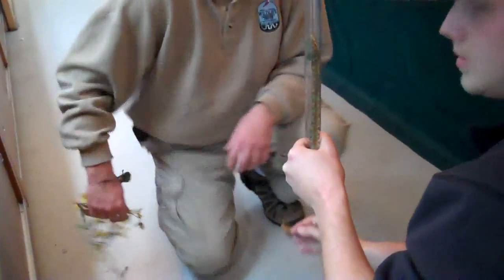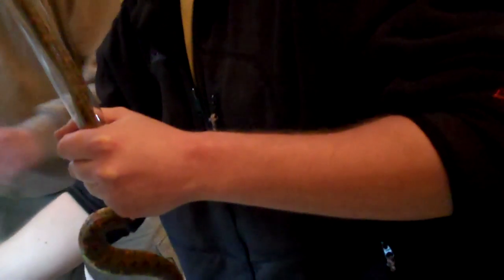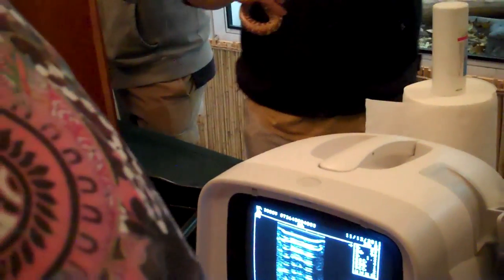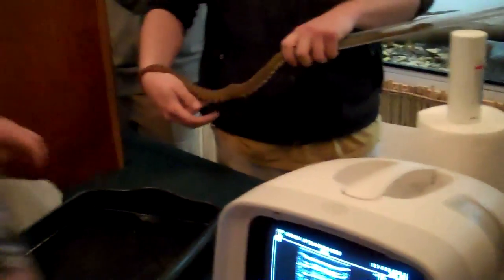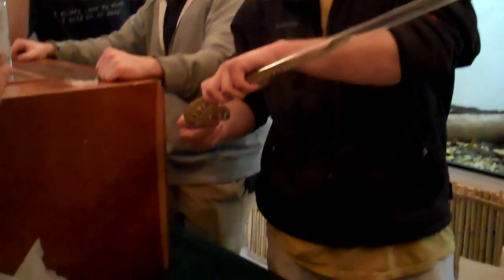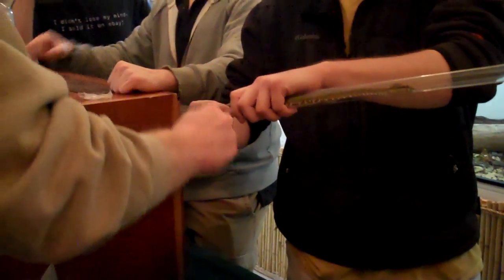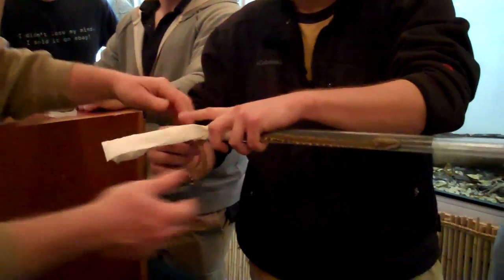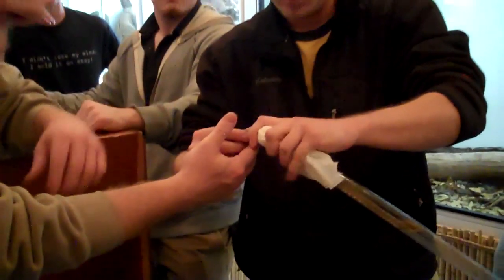Seems to be a lot more cooperative. Eyelash viper, right? All right, so these things here actually have DNA in them, mainly because of the different color variations. We're locked? Lock, yeah. I'm just checking so she doesn't double back. You're not going to have as much to work with. No, that's fine. I just need the bottom third. Punch that in there. Awesome. I'd say we're good.